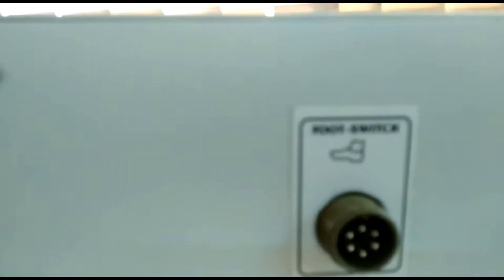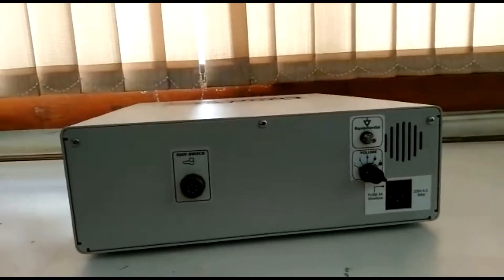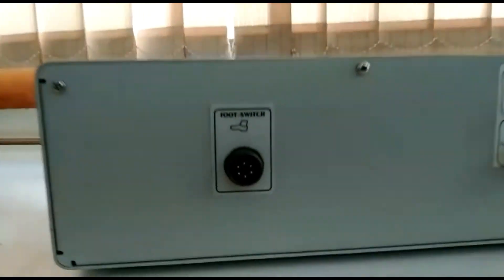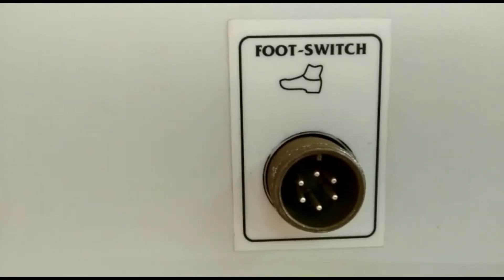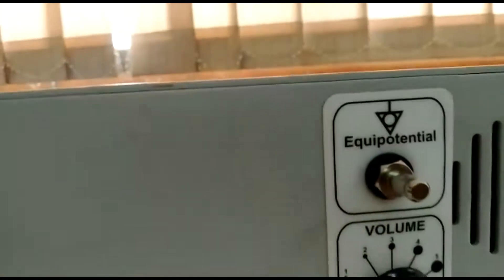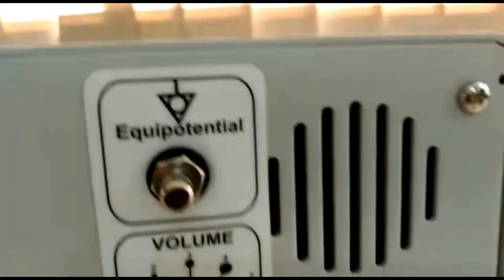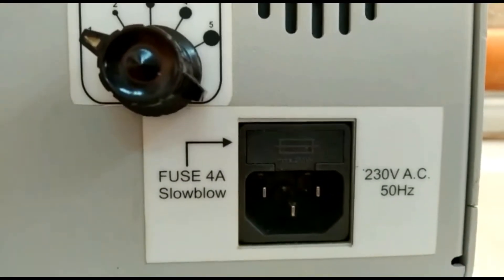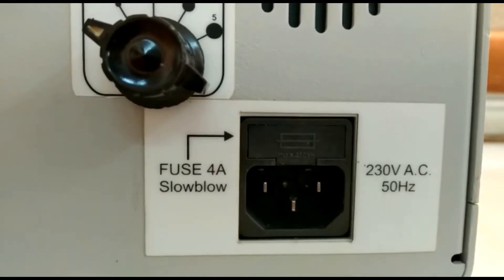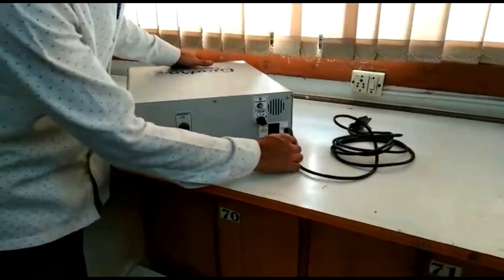On the back side of the machine you have a socket for the foot switch. With Epsilon 400 you get a three-pedal foot switch. There is also an equipotential terminal which is the ground, and a volume control with levels 1 to 5. You also have a socket for the power cord and a fuse holder so that you don't have to open the machine to replace the fuse. The power cord connects to the machine like this.